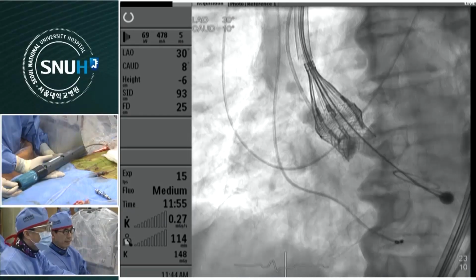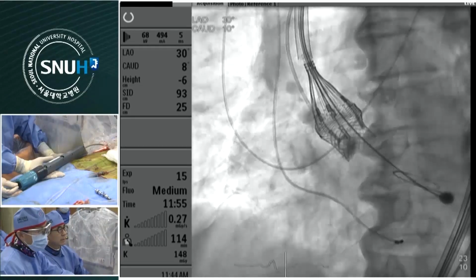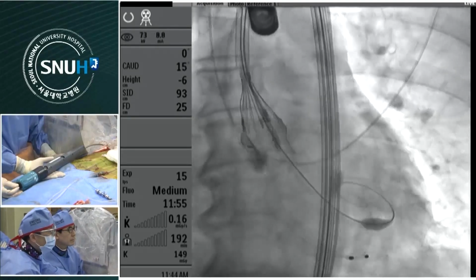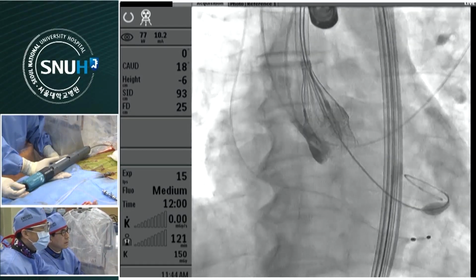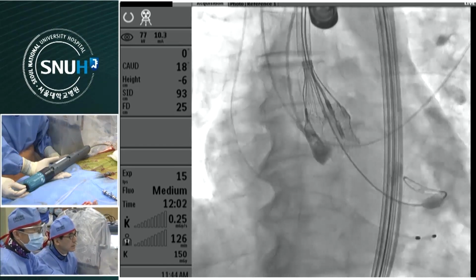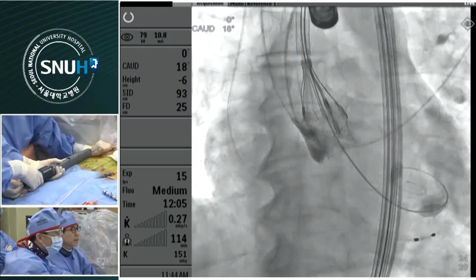It's a little bit high. I agree. In this view, try another angle, the previous angle. It's very high in this angle. And the second one is the central marker does not position in the center of the pigtail. It means that we proceed with additional shortening of the valve until locking.